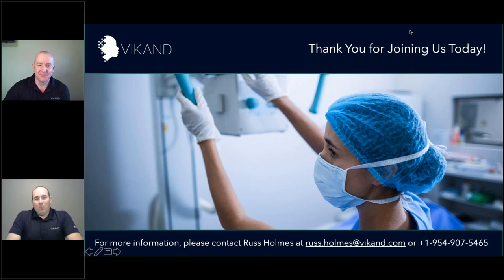Yes. So we focus on the medical equipment, and we focus more or less on a priority. So we're looking at the higher risk items first, ventilators, defibrillators, AEDs, and we start going through all of that. We do a full sweep through the medical center. We discuss it with the medical team on board. We ask them, do you have a secondary medical center where you may have a few items stored? Do you keep any AEDs located throughout the ship that we need to go to that location and verify that?